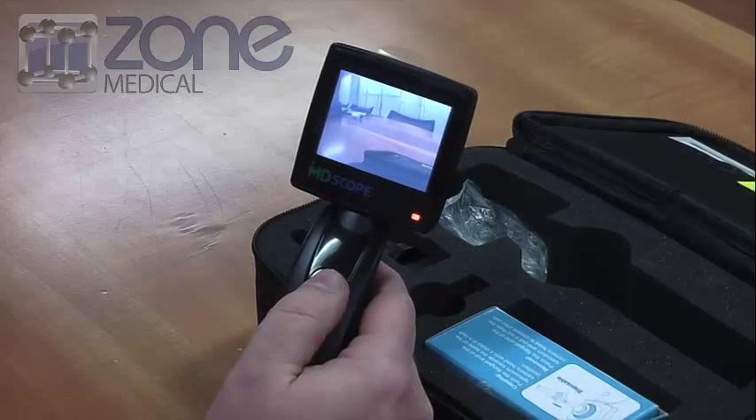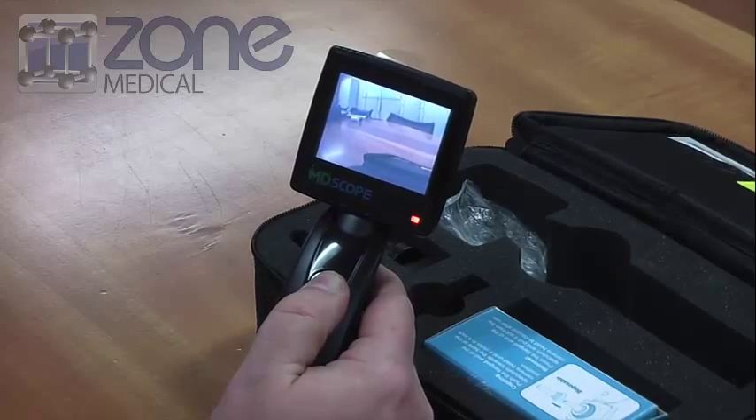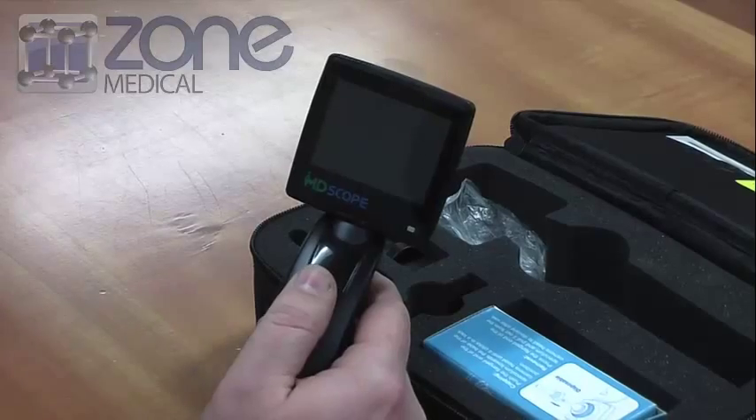To power down the device, simply press and hold the power button and the screen will power down.